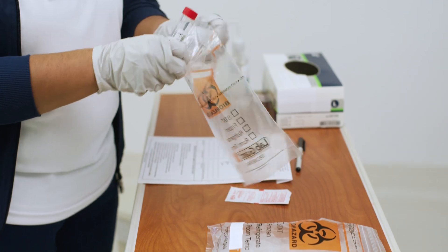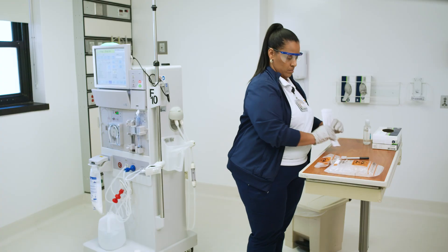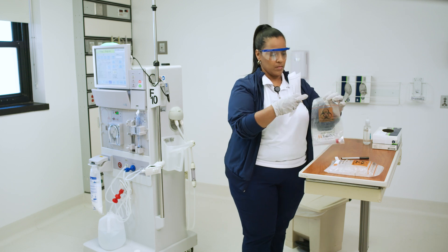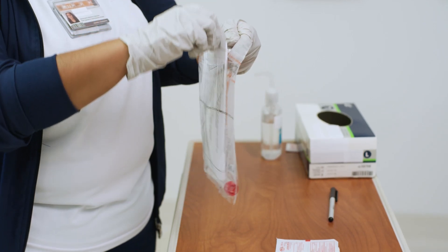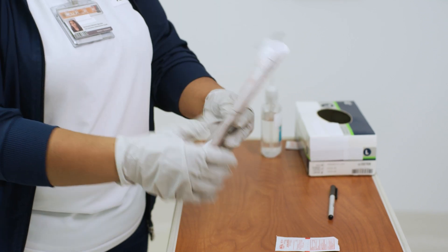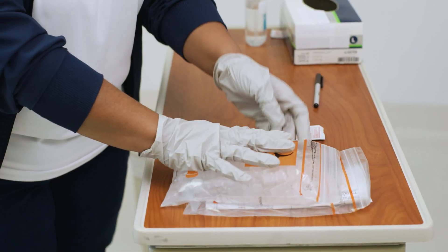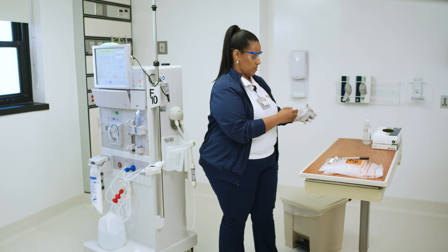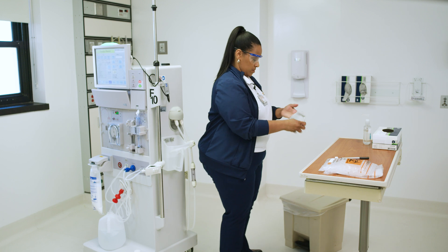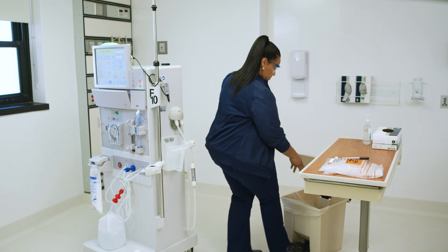Place your sample in a biohazard bag and attach the corresponding form. Place the bag containing the sample on a small bag of ice. Doff gloves and perform hand hygiene. These samples should be assayed within one to two hours of collection, or immediately placed in a temperature-controlled and monitored refrigerator and assayed within 24 hours.